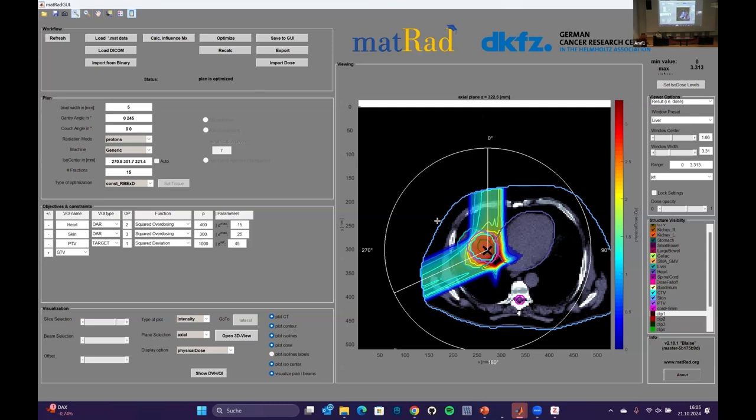I think it's generally a rule: when you can be very precise, usually you only achieve this precision when you know all your conditions very well. And since you are not so knowledgeable about all the conditions and have a high sensitivity to the conditions changing, you can end up with large uncertainties. So that's one of the things to consider.